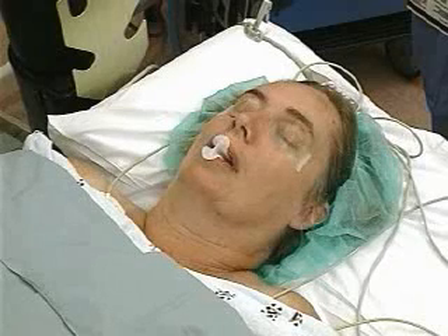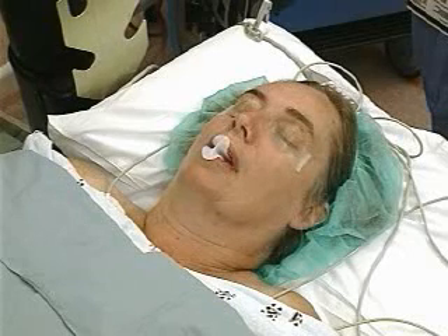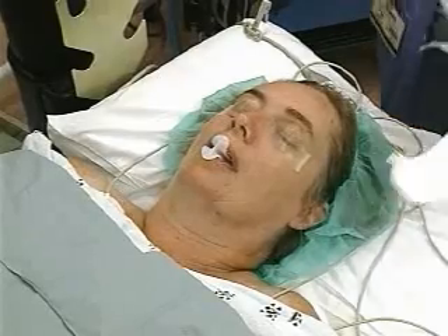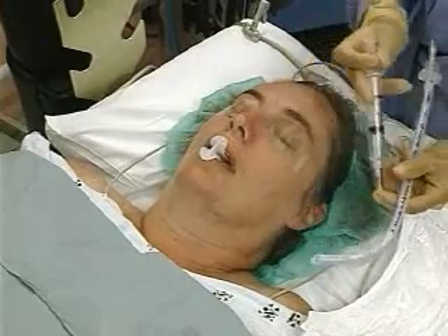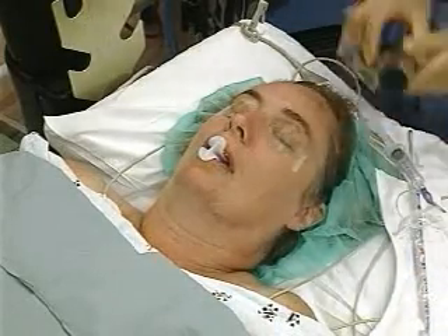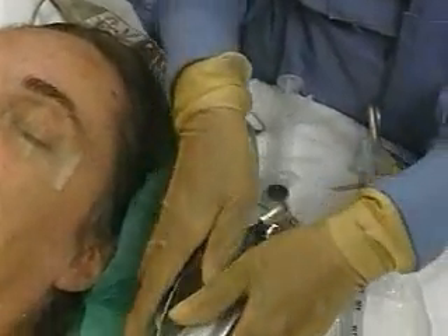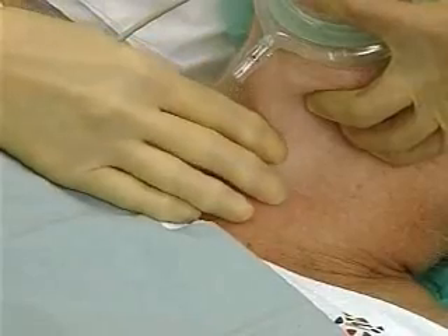If the patient is horizontal and unconscious or if oral intubation is planned, the patient's position should be supine with the head in the sniffing position. If the patient cannot tolerate lying flat, the patient may remain sitting for blind nasal intubation. Check the endotracheal tube cuff for leaks by inflating and deflating the balloon with 10 milliliters of air, and check the laryngoscope to ensure the light is functioning. Pre-oxygenate the patient with bag mask ventilation.